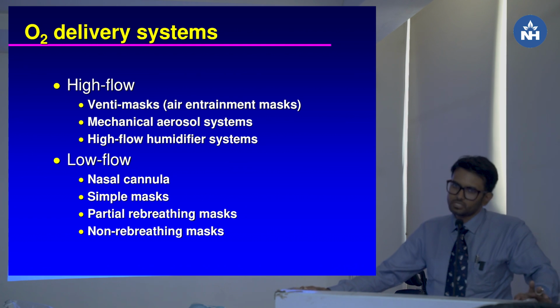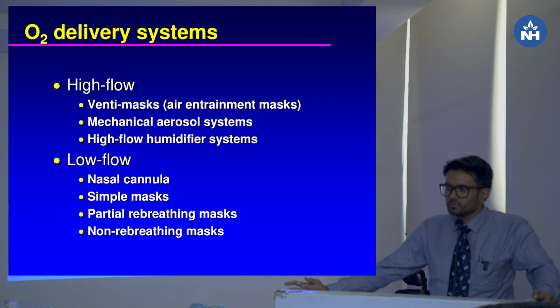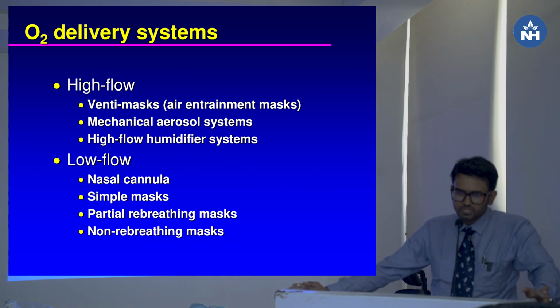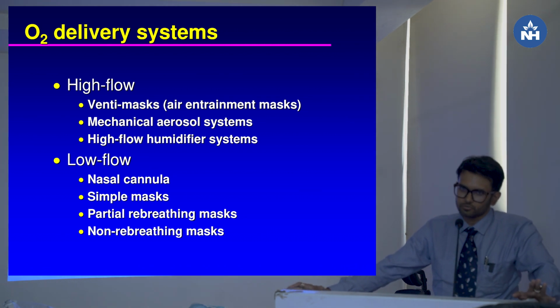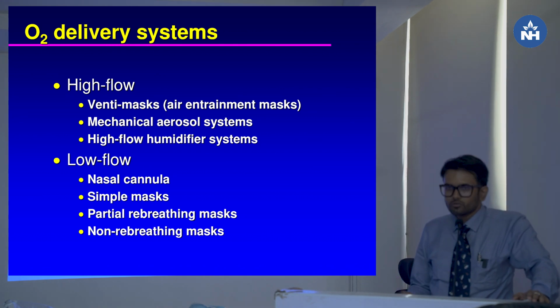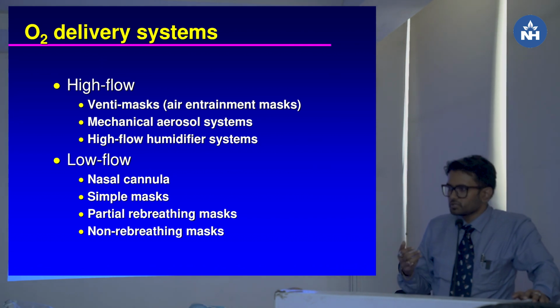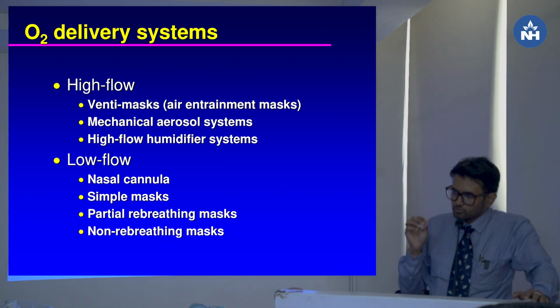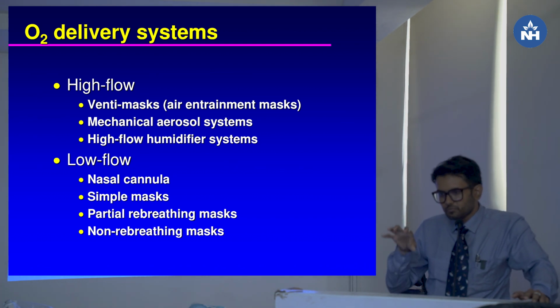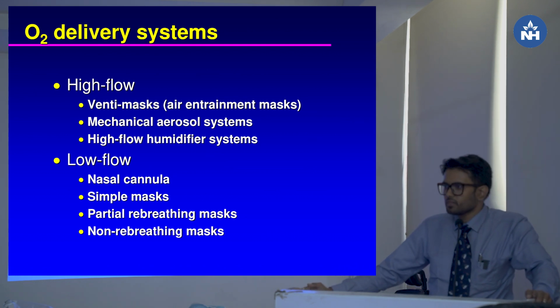If the patient is on spontaneous respiration, we can start with low flow if they can tolerate spontaneous breathing. But if the patient has a definite airway, is on positive pressure ventilation or intubated, or is already on NIV, then depending on the patient scenario, we have to choose the instrument for transport.